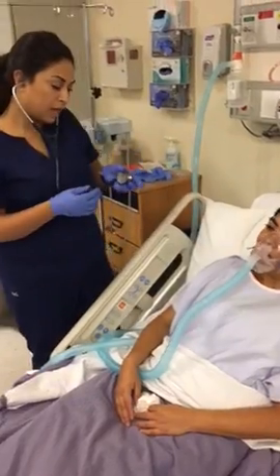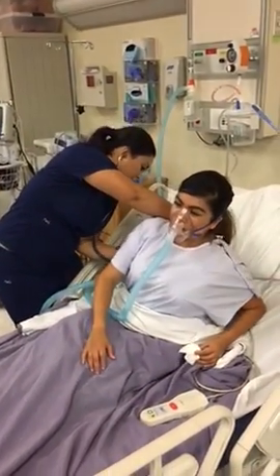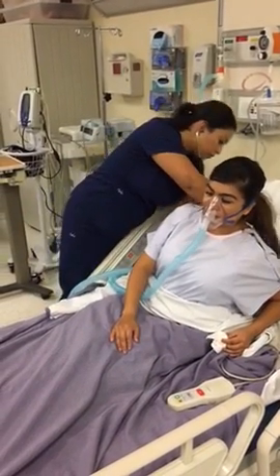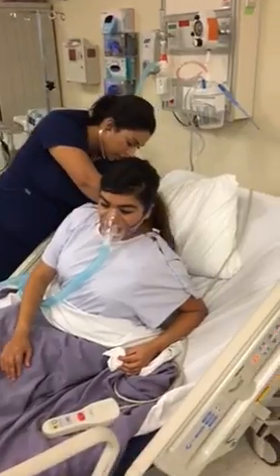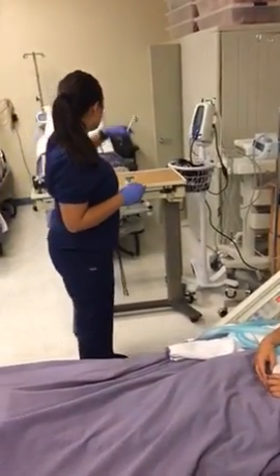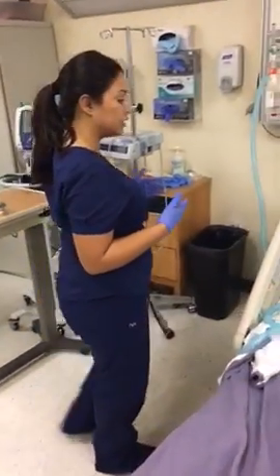Can I ask you to maybe lift up just a little bit? Okay. Is this okay? You can go ahead and relax. Okay, so everything sounds really good. It sounds better than it did earlier, and the breath sounds nice and clear.